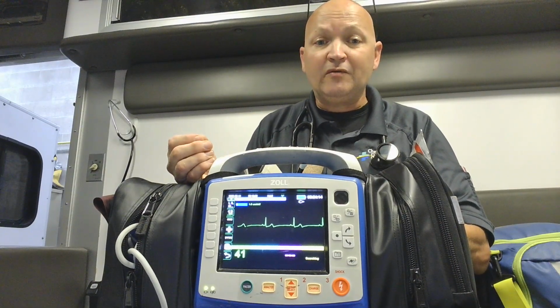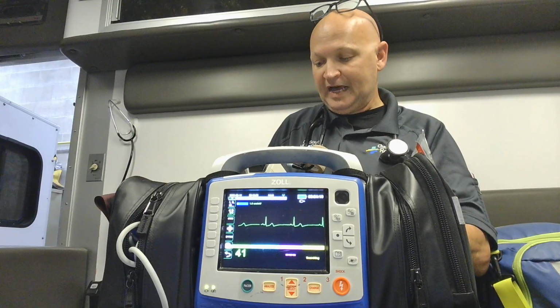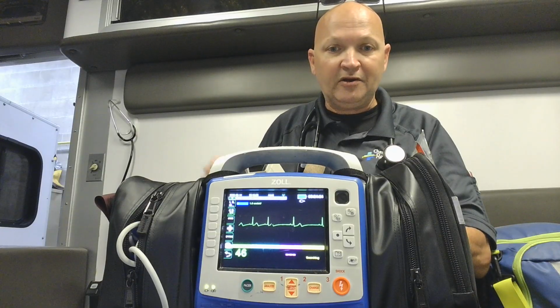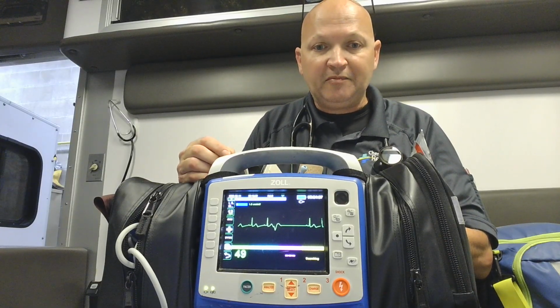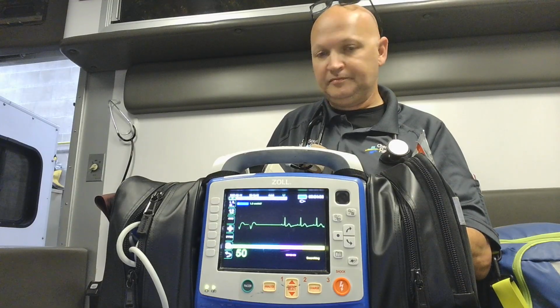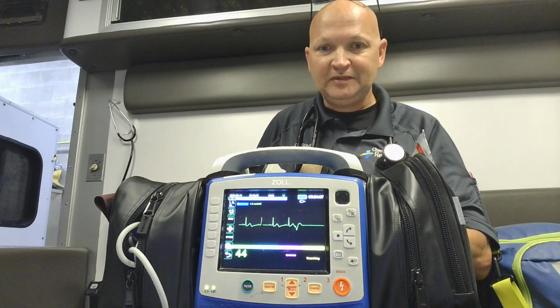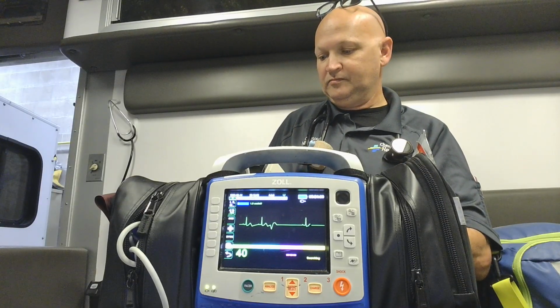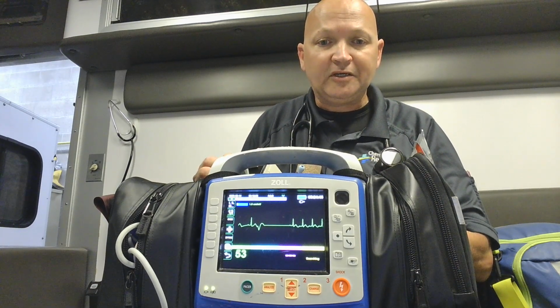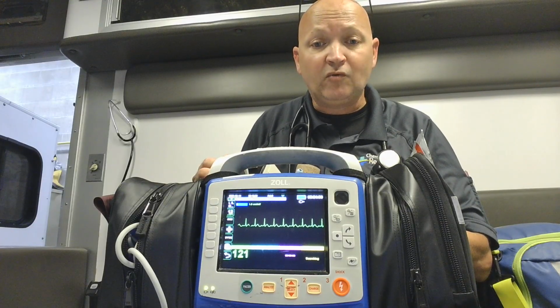Now, heart rates that are greater than 100 and regular are known as sinus tachycardia. Sinus tachycardia is a rate greater than 100, so you can see the heart starting to speed up just a little bit. There's a PVC on there, so give it just a second to start doing its thing. Now we're going to see the heart rate speed up, and it's going to be greater than 100. So let's watch it. It starts getting faster. It's at a rate of 121.